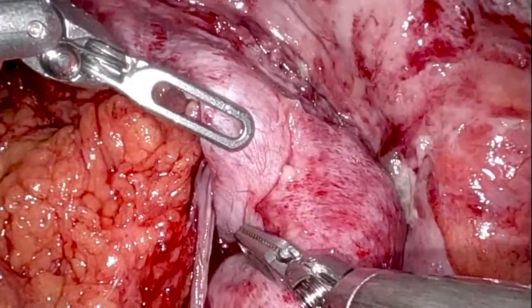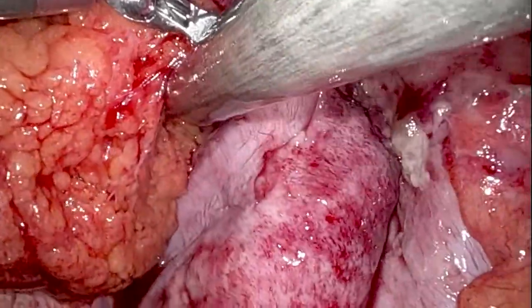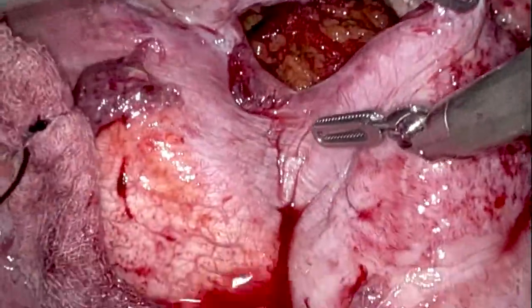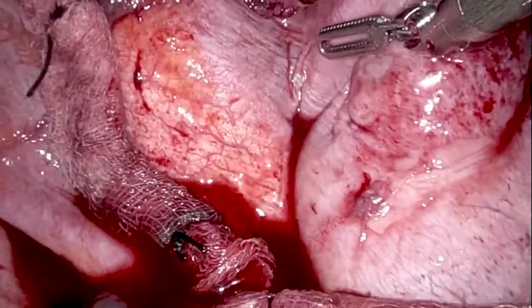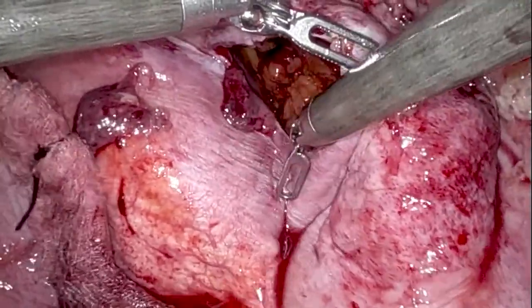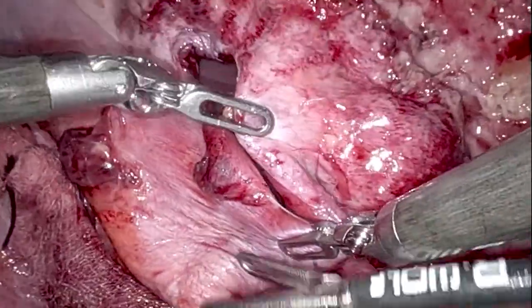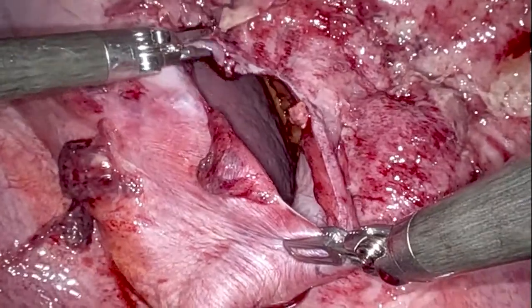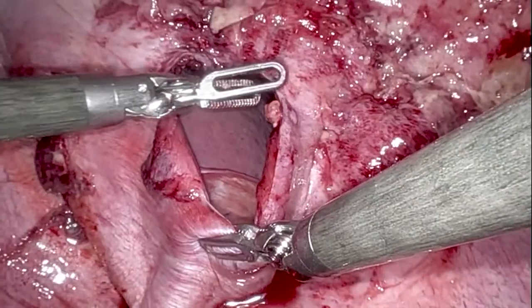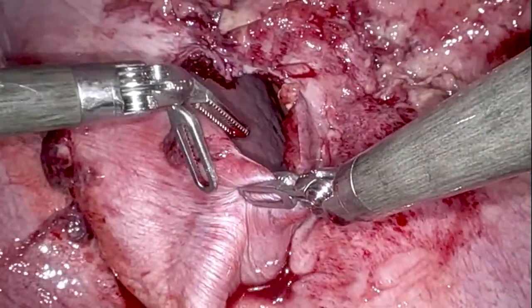The surgeon uses the cadier forceps to lift the diaphragm while the positive pressure from the CO2 in the thorax helps push the greater omentum back in. Through the hole you can see the upper border of the spleen, which shows no lacerations — always a good sign. Because this was a penetrating stab wound, the diaphragm edges are very clean and will be straightforward to suture.